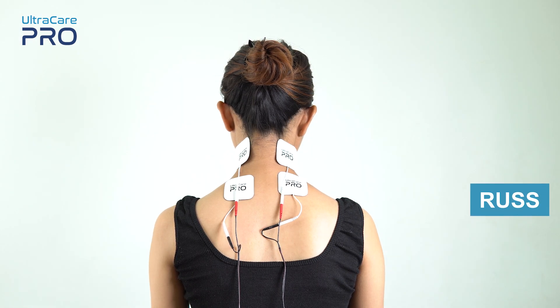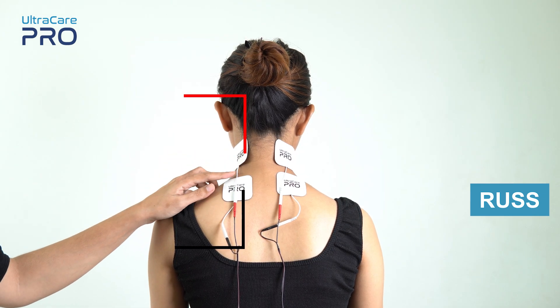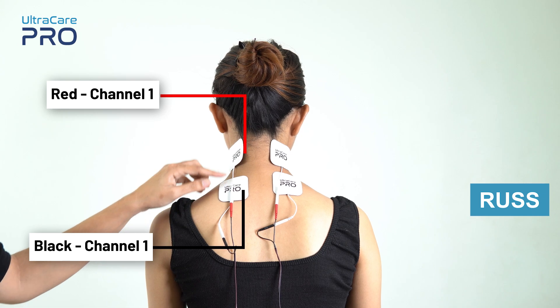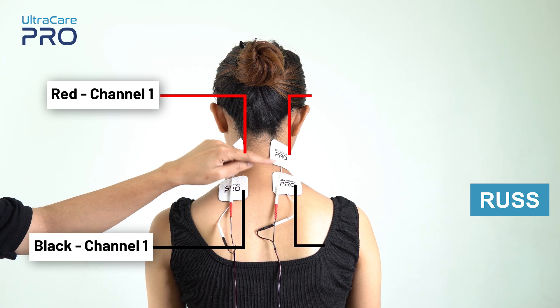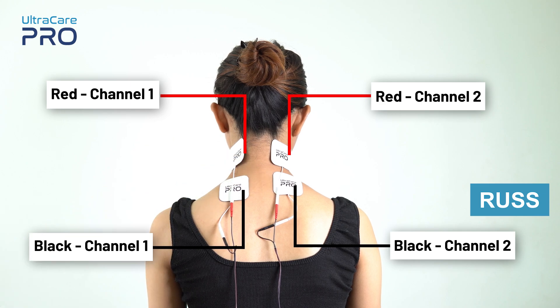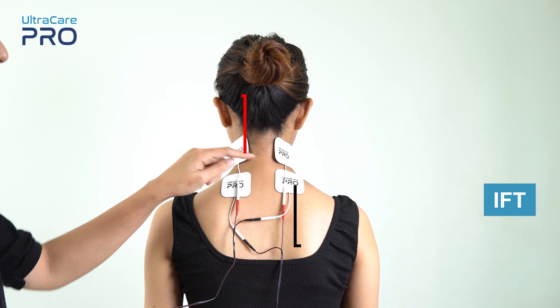For Russian currents on the neck region, place the red and black electrode from channel 1 on the muscle that needs to be stimulated. Similarly, place the red and black electrode from channel 2 over the other side of the neck region over the muscle that needs to be stimulated.